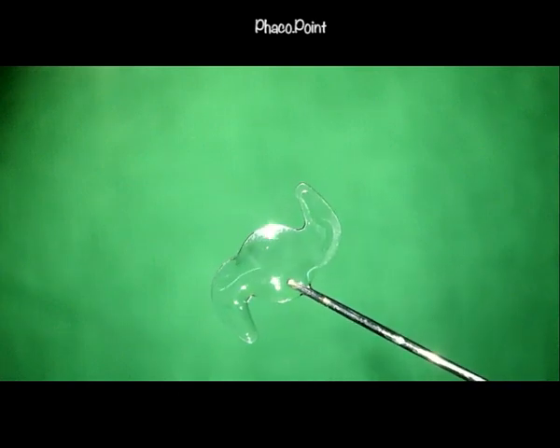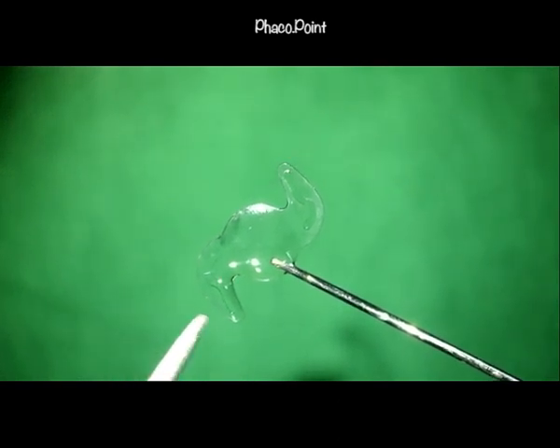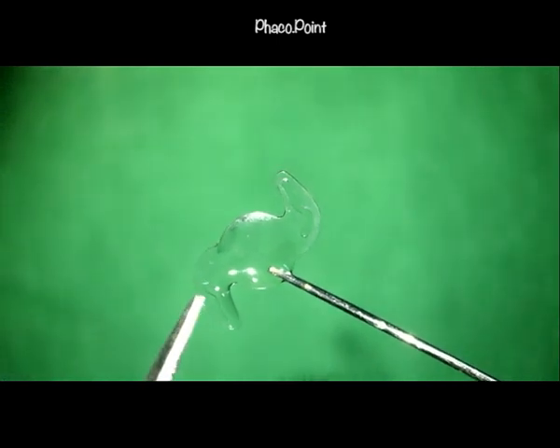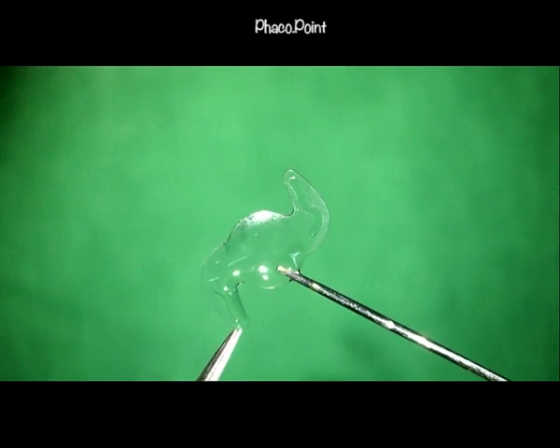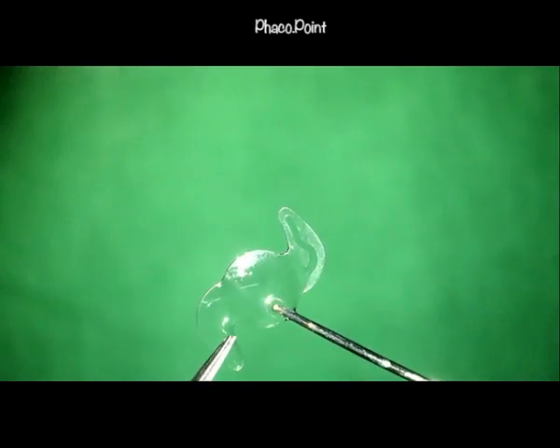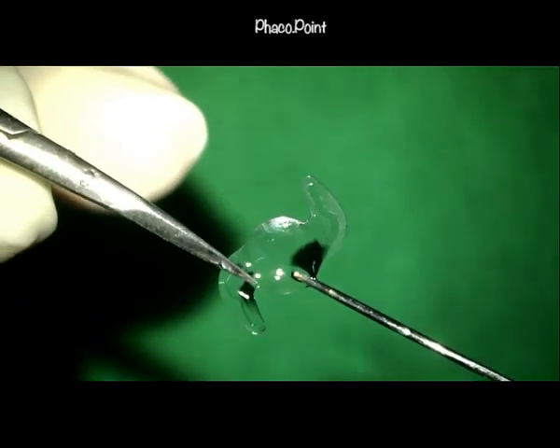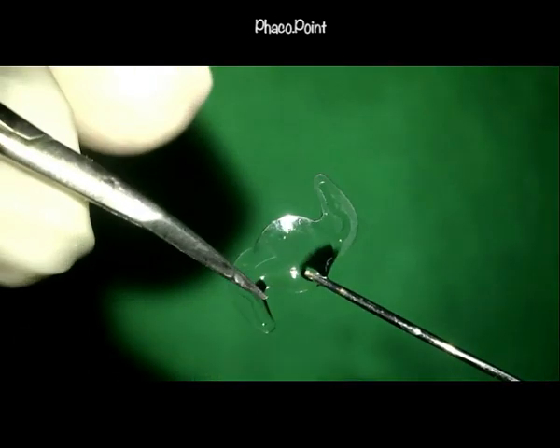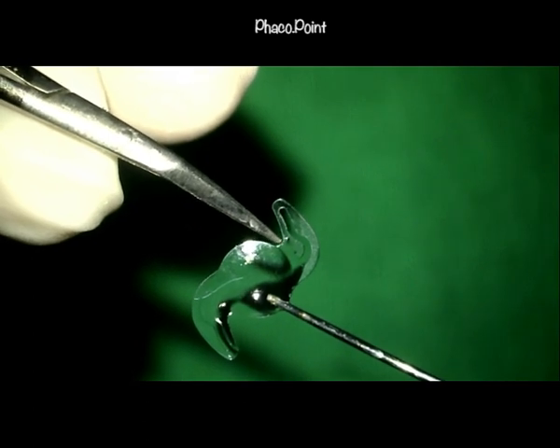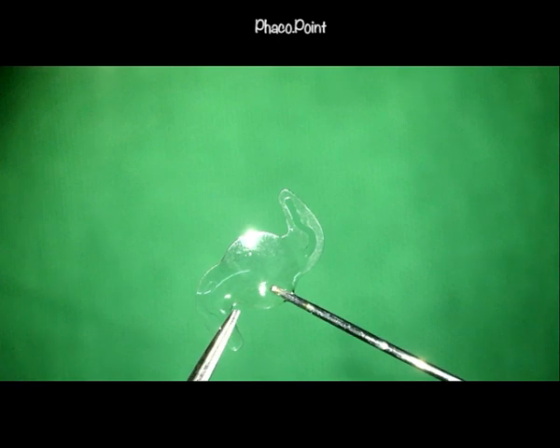Moving on to what the orientation of the lens should be: the main incision is made at approximately 65 degrees, which means the scissors used to cut the IOL will be introduced through the main incision. If cutting the lens with the scissors entering at about 65 degrees, the IOL orientation should be such that we start to cut at the inner edge of the superior optic-haptic junction and move across diametrically 180 degrees to end at the inner edge of the inferior optic-haptic junction. The orientation must allow the scissors to very easily reach the proximal optic-haptic junction.